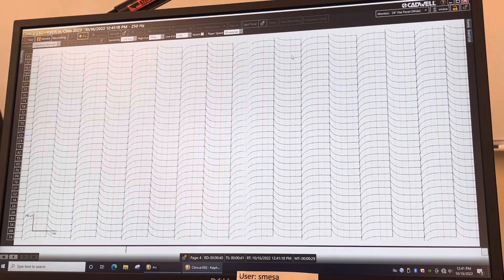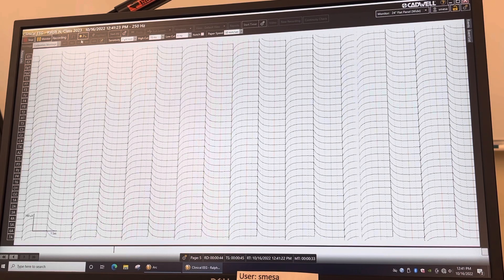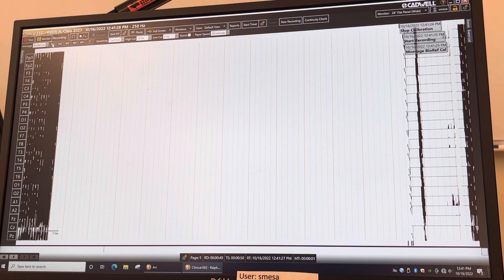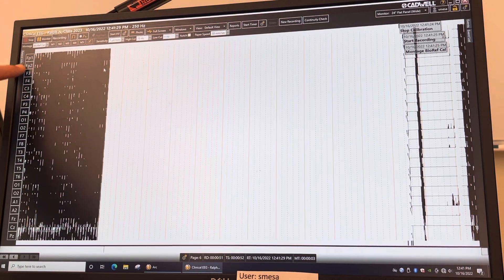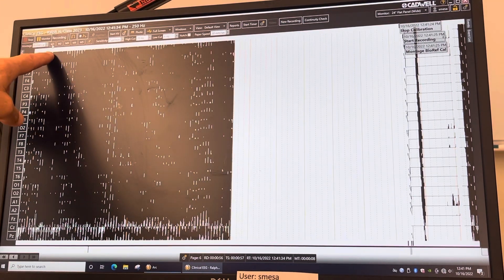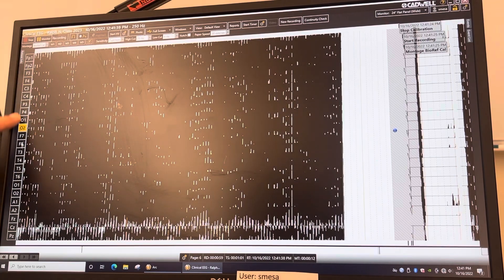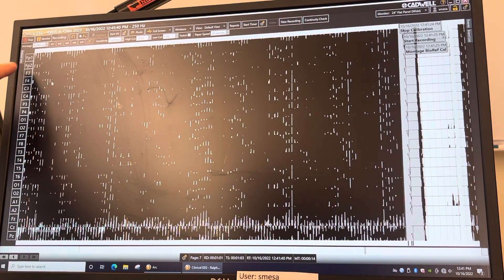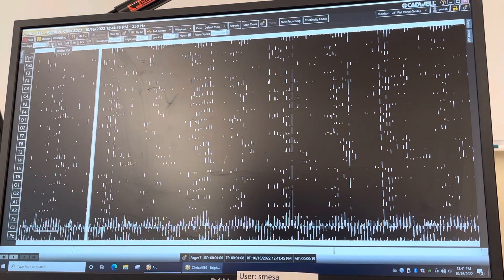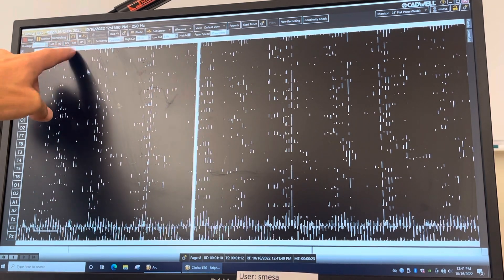It's recording now. When you first start recording, run a couple pages — about 10 to 20 seconds — of calibration, then turn it off. Then go to the bio ref cal right here and click M1, and the bio ref montage will come on. So we're doing a mechanical cal first, then the bio ref cal.